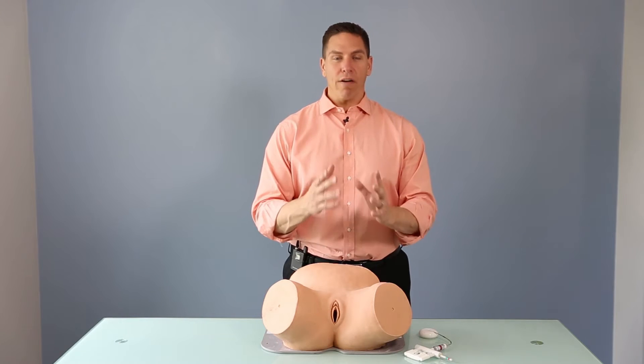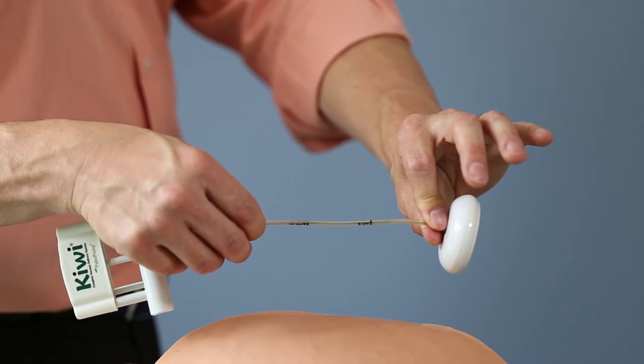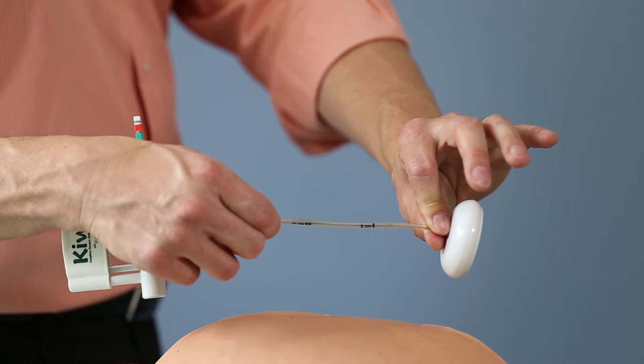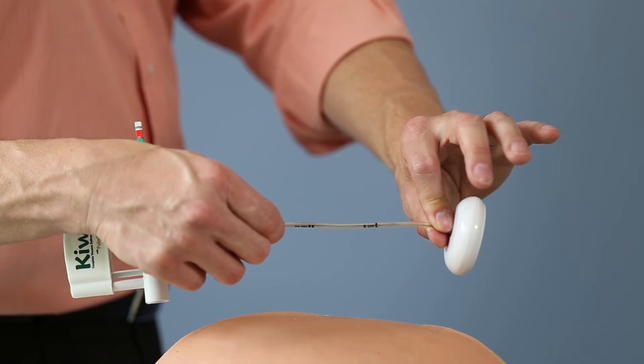This references the marks found on the Kiwi Omni Cup. On every Kiwi Omni Cup, there are marks on the stem at 6 and 11 centimeters. Those marks are designed to coincide with the marks naturally found on your hand.